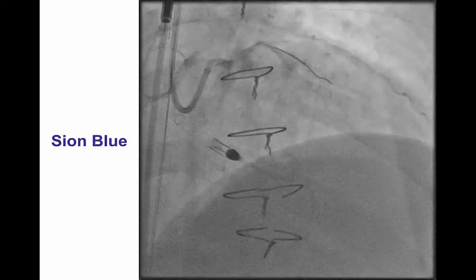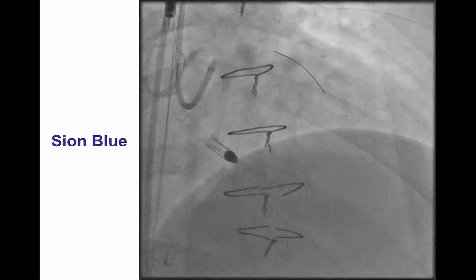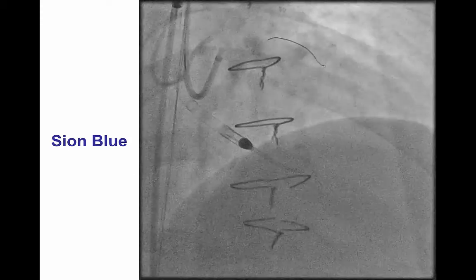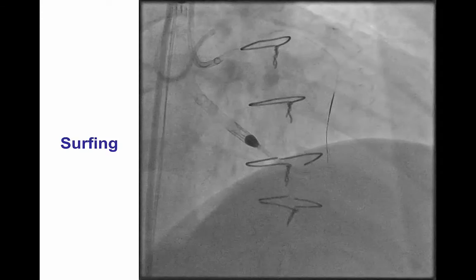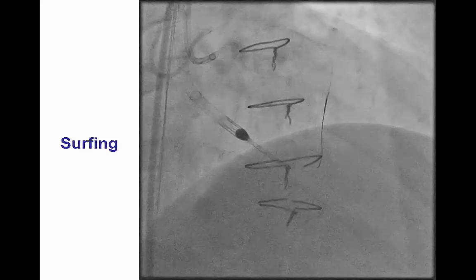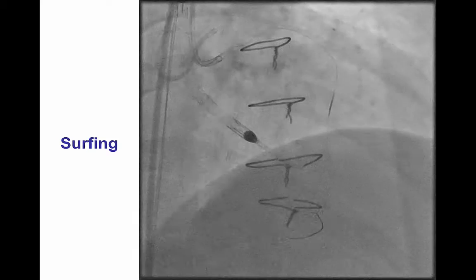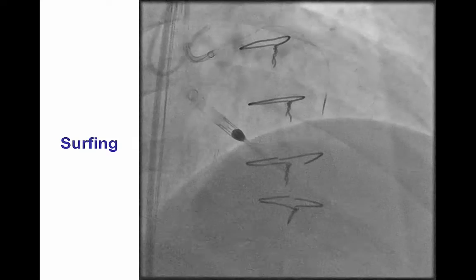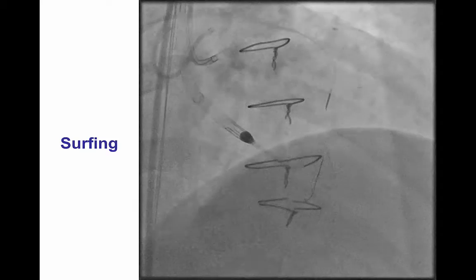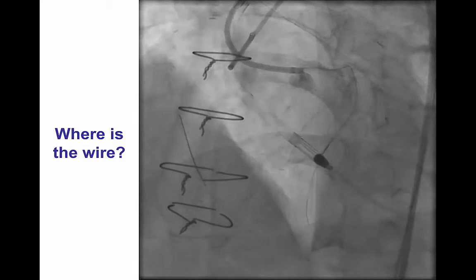A workhorse Sion Blue wire was advanced into a septal branch and then followed by a Corsair catheter. We performed surfing with a Sion wire and were then able to advance into the posterior descending artery, as confirmed by angiography.